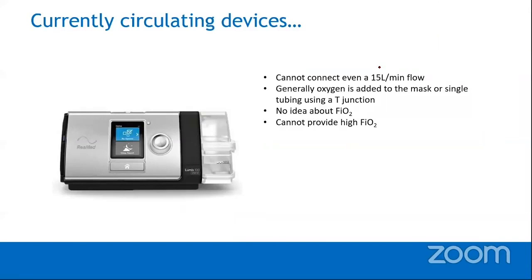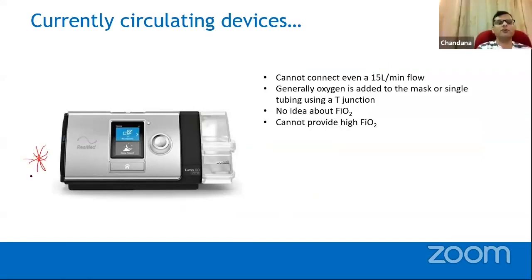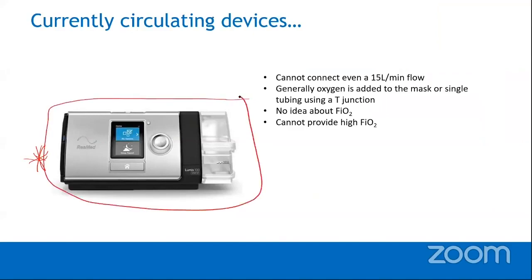Okay, this is actually the dangerous device at the moment available in the system. This has no oxygen connection. So what they say is, you can connect oxygen to the face mask. But I don't recommend that one.